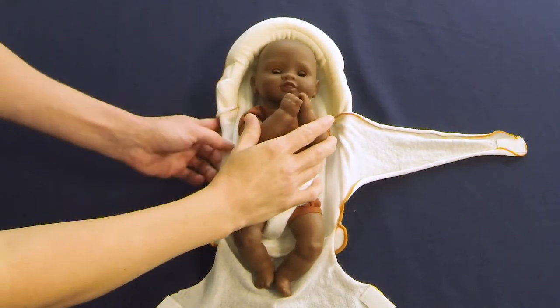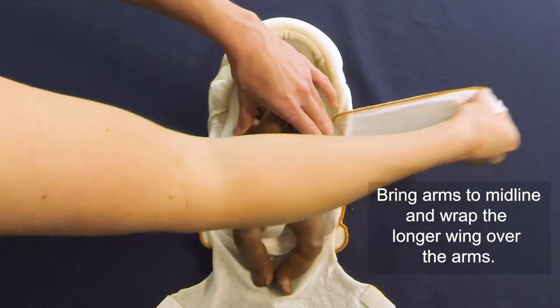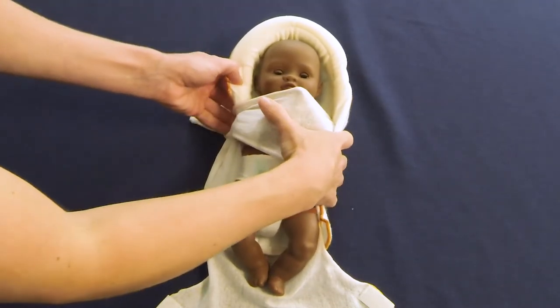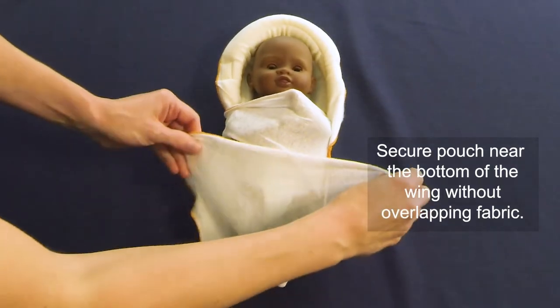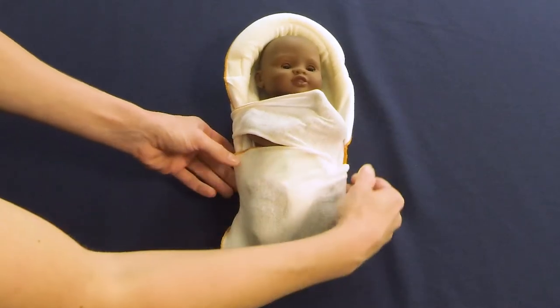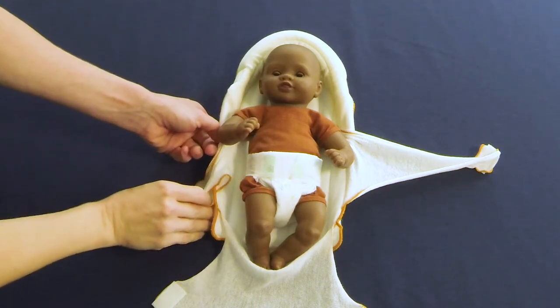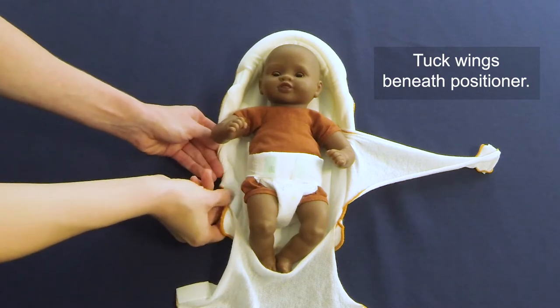Another alternative involves using the pouch and one wing to provide a single layer of covering. Place the arms across the chest with hands near the face and then wrap the longer wing around, securing the arms in a flexed, contained position. Bring the pouch up to the lower border of the wing without overlapping the fabric; excess fabric from the pouch can be rolled at the edge to fit. The infant can also be covered from feet to shoulder with only the pouch, leaving the wings unused and tucked under the positioner.